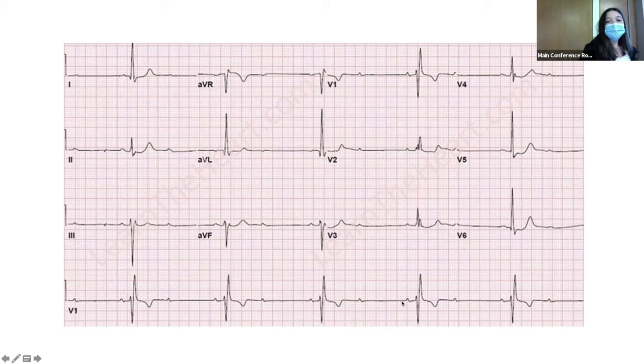So we can't tell if this is actually fixed because you have a conducting P wave and then a non-conducting P wave. So we don't know if it would have marched. We don't know if it would have stayed fixed. In some cases, ways you can potentially tell, if this was a wide QRS complex, most likely it would be a type 2. But if you see a patient like this in the ED, even if they are completely stable and asymptomatic, you can't rule out that this is not a type 2 block. So you would need to manage it as a type 2 block.